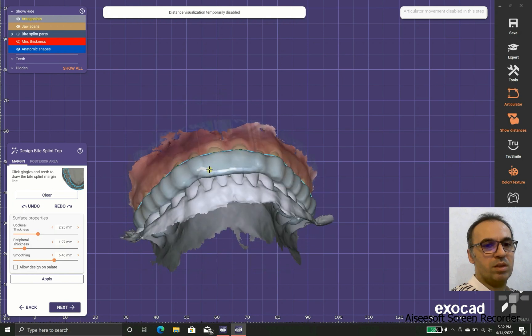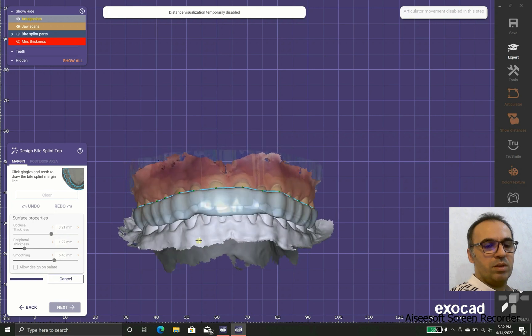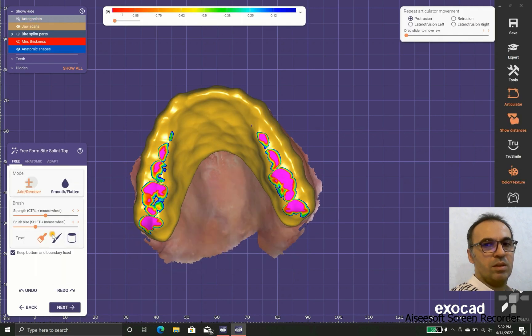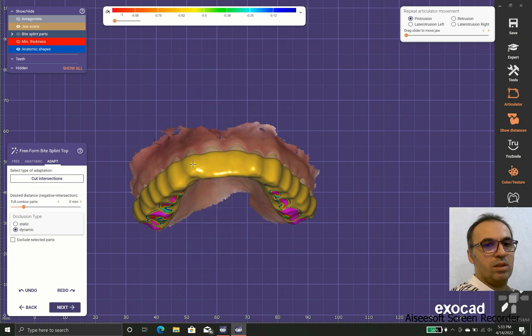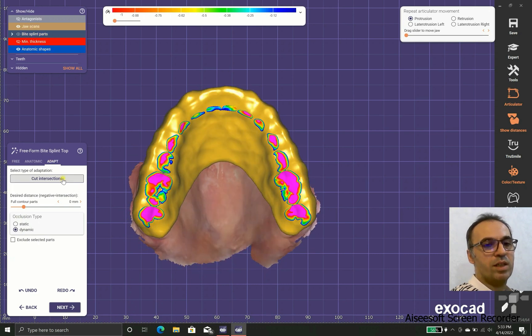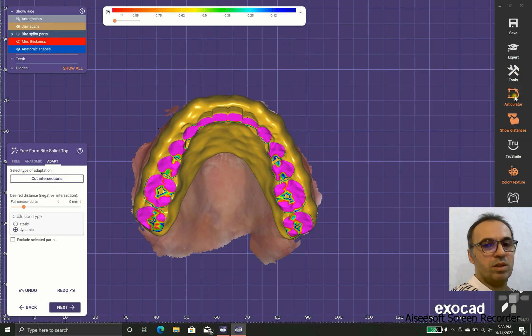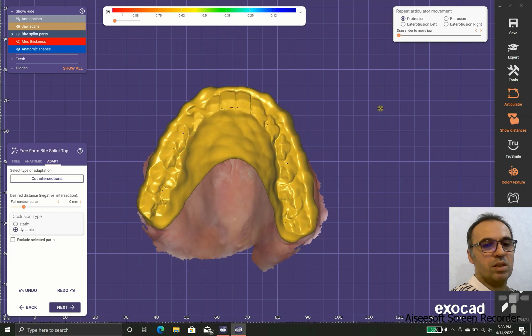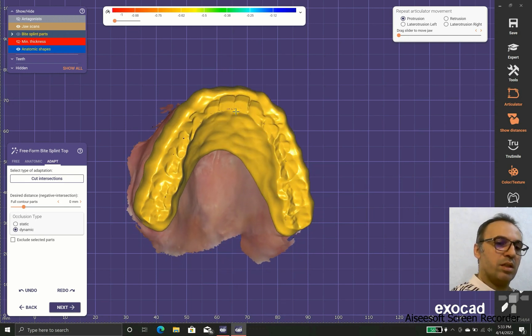Now we are going to cut the parts and check with the antagonist, and after that we are going to free-format because we don't have any contact in the anterior area — we add a little bit of thickness over there. In the intersection settings we have static and dynamic; in this case we use dynamic because we are using the articulator, and as you can see the movement of the condyle is projected on the aperture.